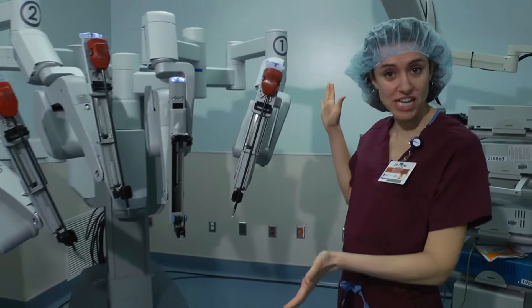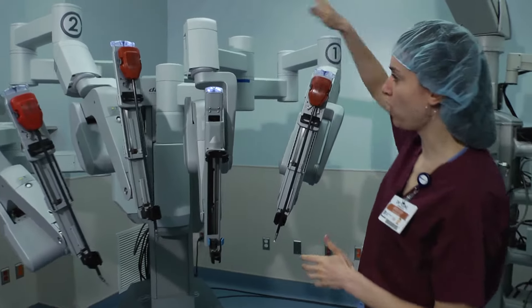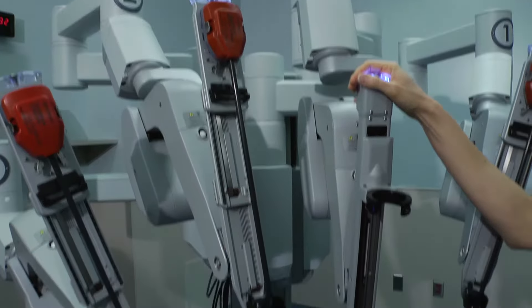This is the DaVinci S forearm robot. What we have here is four arms. Arms one, two, and three have equipment in them, and the other arm here is reserved for the camera that looks inside the body.